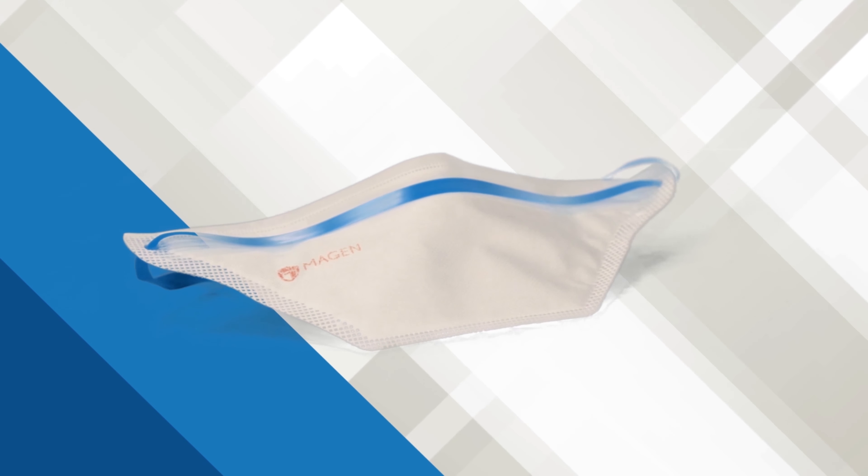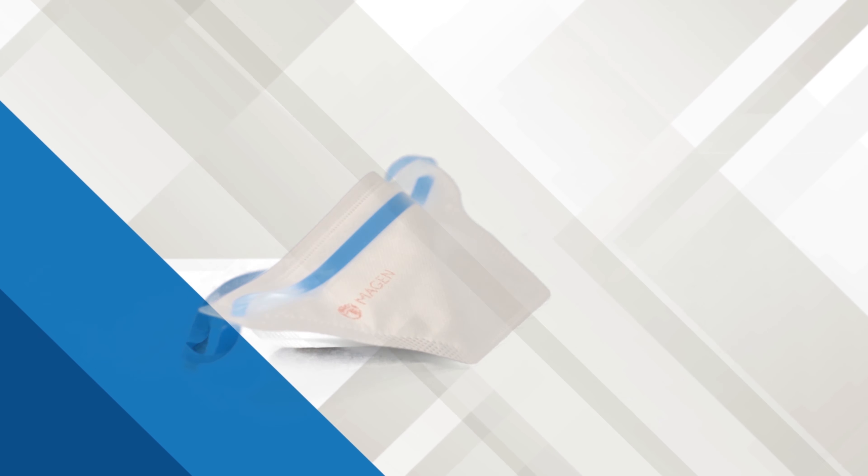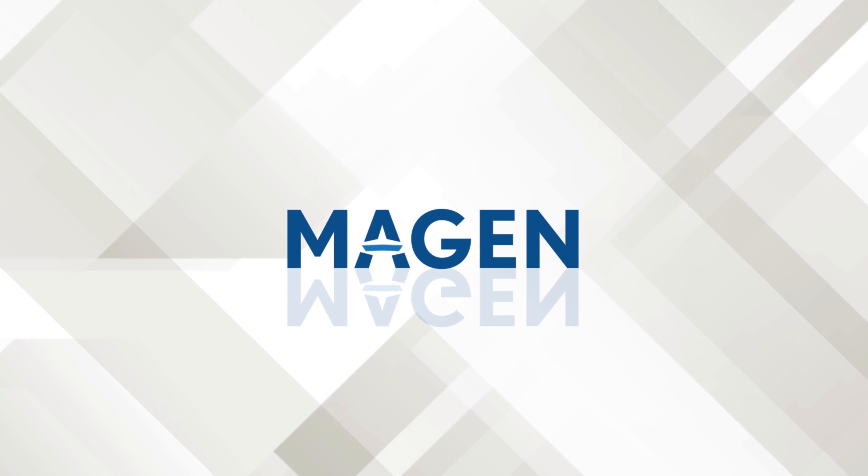Perform a fit check again. Please make sure you repeat this procedure until you achieve a secure, comfortable and tight fit. If you cannot achieve a proper fit, do not enter the contaminated area.